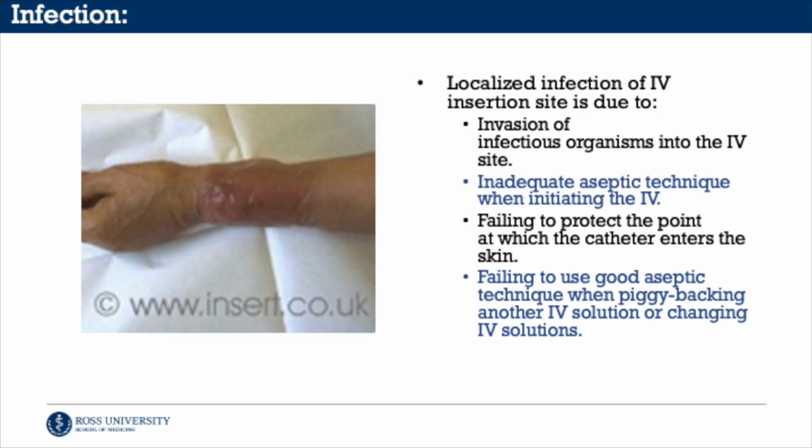Any procedure which causes breaking of the skin barrier poses a risk of infection localized to the IV insertion site. This could be due to invasion of infectious organisms into the IV site, inadequate aseptic technique when initiating the IV, failing to protect the point at which the catheter enters the skin, or failing to use good aseptic technique when piggybacking another IV solution or changing IV solutions.